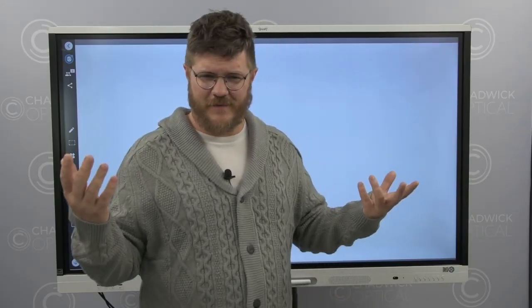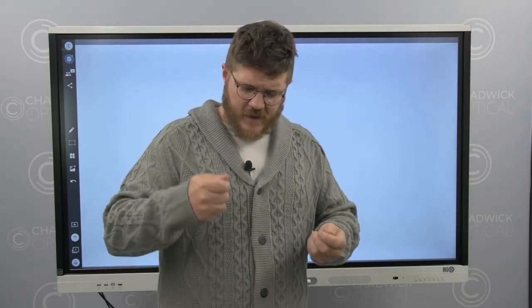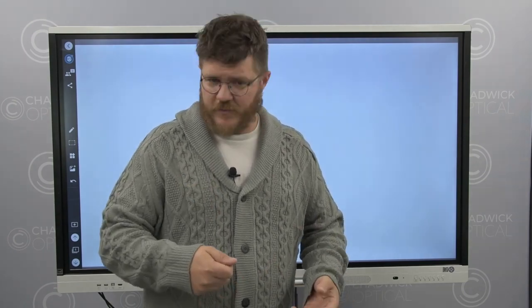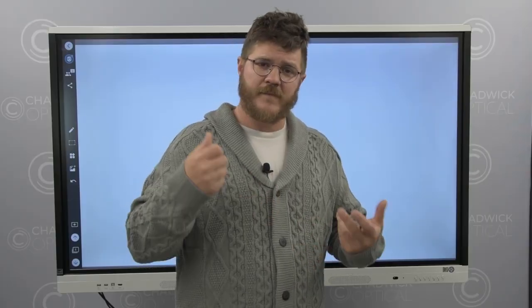What do we use instead? Instead of magnification like 3x, 4x, 5x, we use diopters. A diopter is actually the focal length of a lens. If you remember from grade school, you may have taken a magnifying glass and held it at a certain point and set a piece of paper on fire or something like that. That's the focal length of a magnifier.